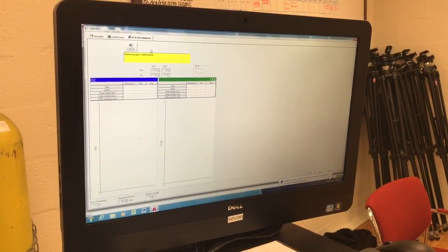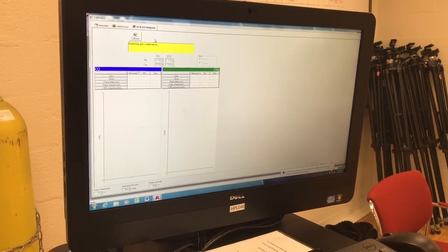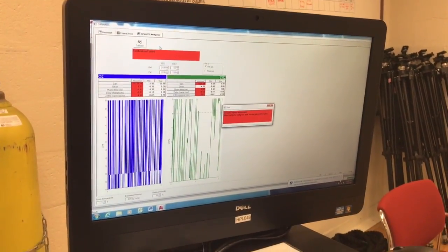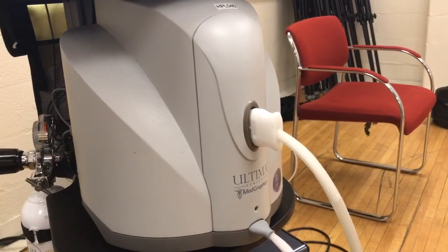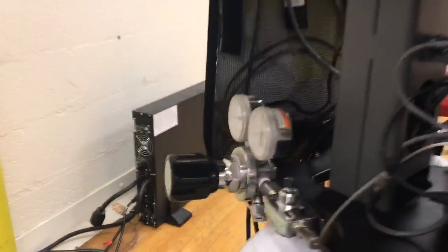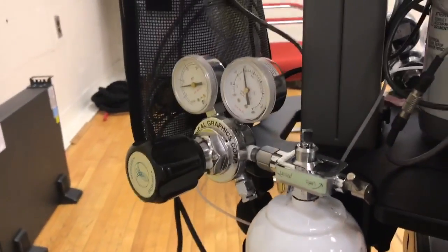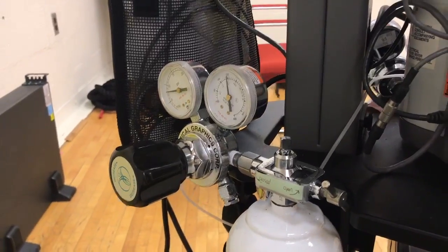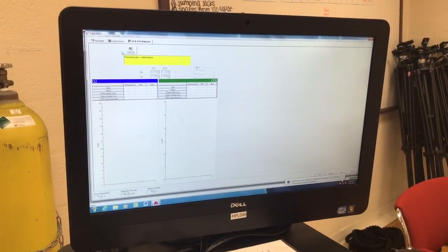The calibration may fail the first one or two times. If it fails more than three times, make sure the umbilicus is plugged into the cart. Also recheck the gauges on the gas tanks to make sure they are open. If it keeps failing, you might have to recalibrate.